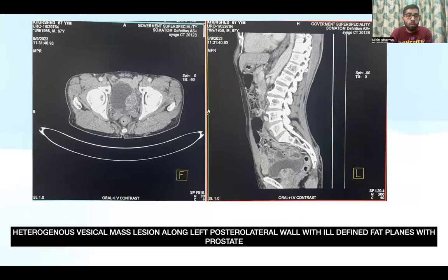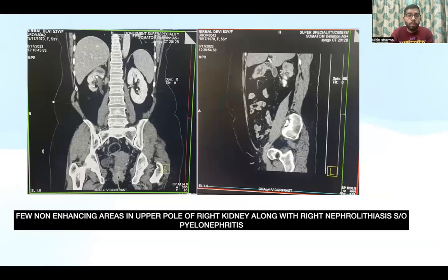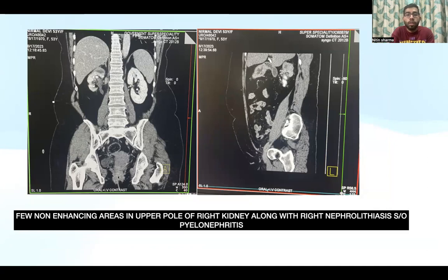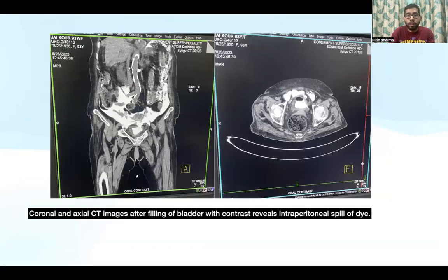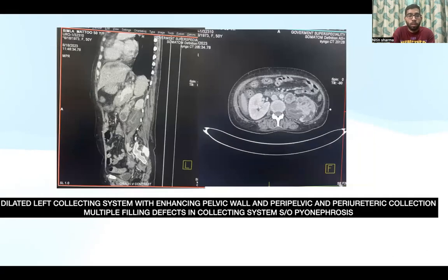This is another case of a vesical mass lesion showing a heterogeneously enhancing lesion along the left posterolateral wall with ill-defined fat planes with the prostate. This next case shows a hypertensive and diabetic patient presenting with fever, where contrast-enhanced images revealed non-enhancing areas in the upper pole of the right kidney along with right nephrolithiasis, with findings suggestive of pyelonephritis. Another case showed trauma after catheterization with intraperitoneal spill of dye following contrast administration through a catheter from the bladder. A further case shows a dilated left collecting system with enhancing pelvic wall and periureteric collection and multiple filling defects in the collecting system, suggestive of pyonephrosis.